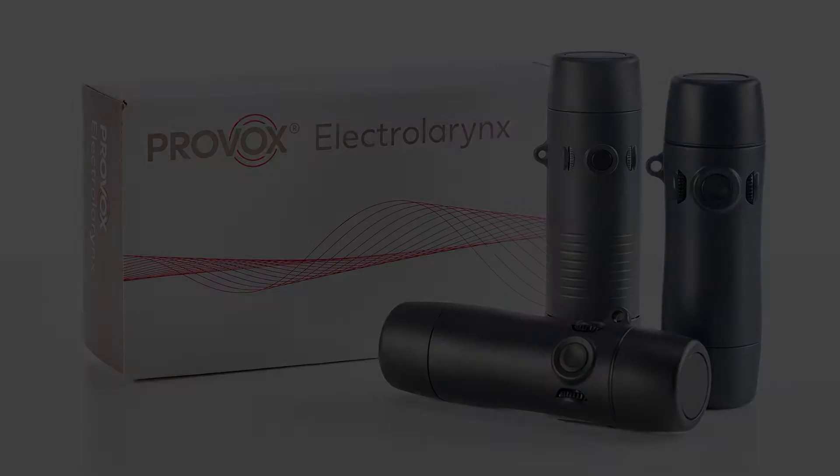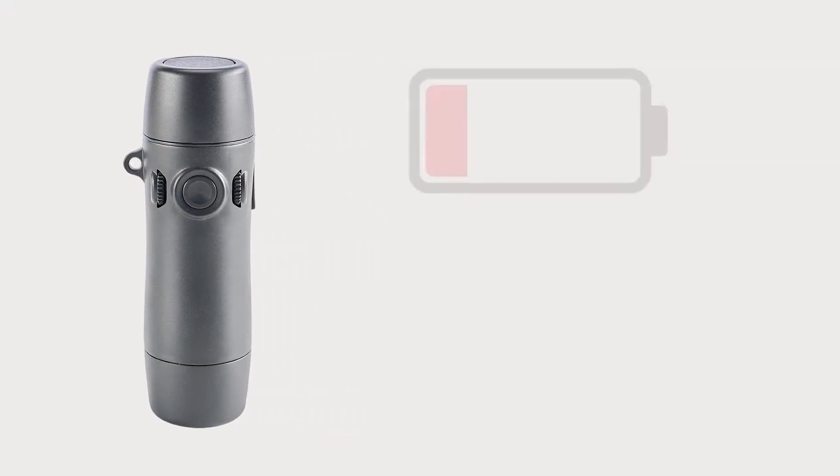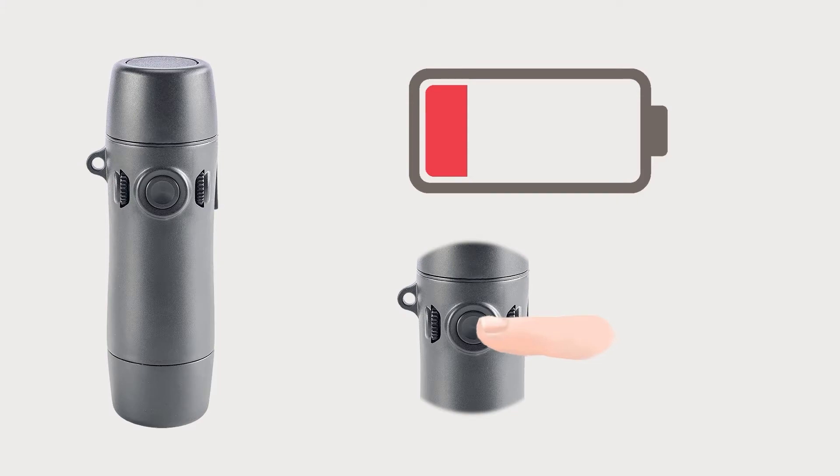In this video we will discuss the most common issues that can impact the functionality of your electrolarynx and some basic steps to get your device back to a working condition. The two most common issues that can affect your device are a low battery or a sticking button.